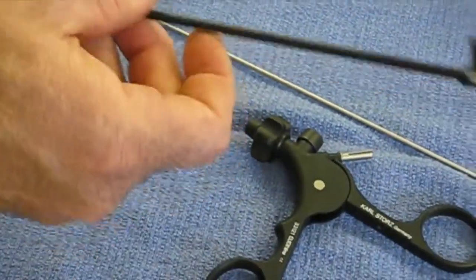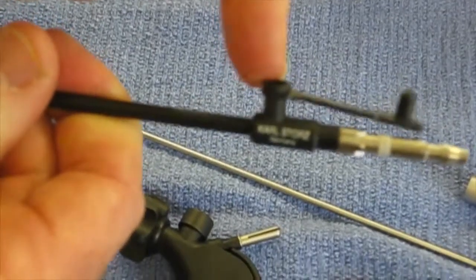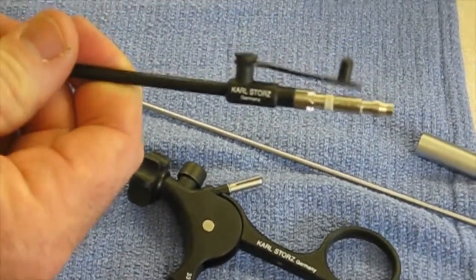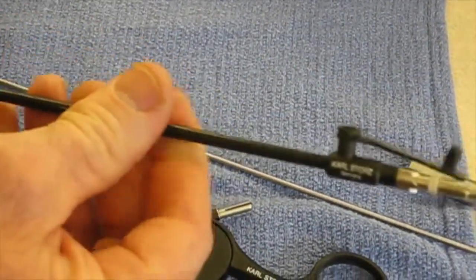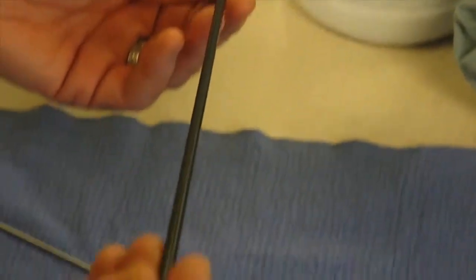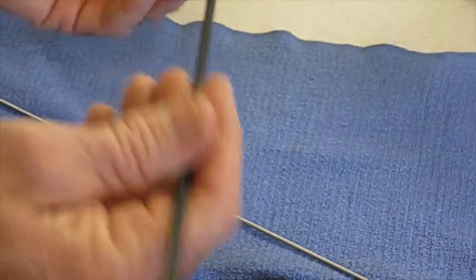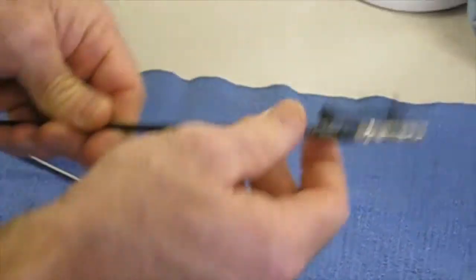Lastly, you want to take the flush valve of the insertion tube. You can hook up a syringe with the enzymatic cleaner in there and flush enzymatic cleaner into the tube to get out any organic matter. There's a brush that runs down the distal end of the tube, and it'll come out all the way to the proximal end. And once you get rid of that organic matter, then I would flush once again with distilled water or clean tap water.